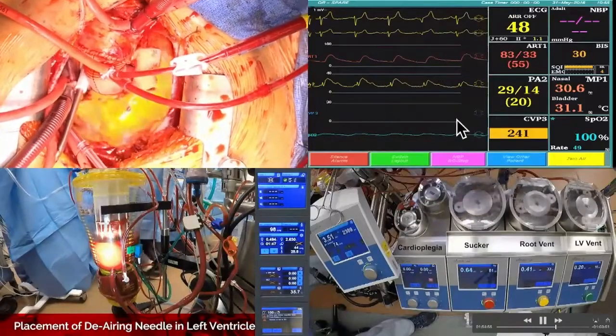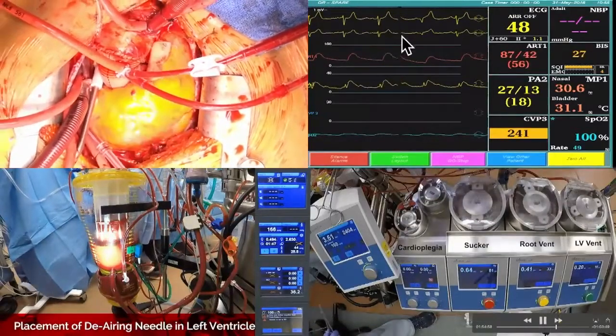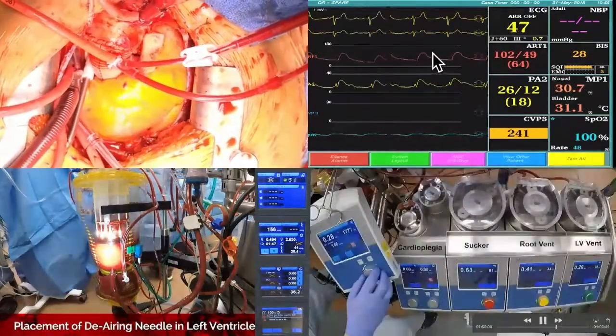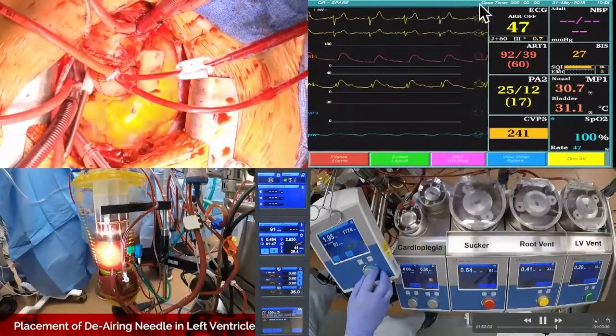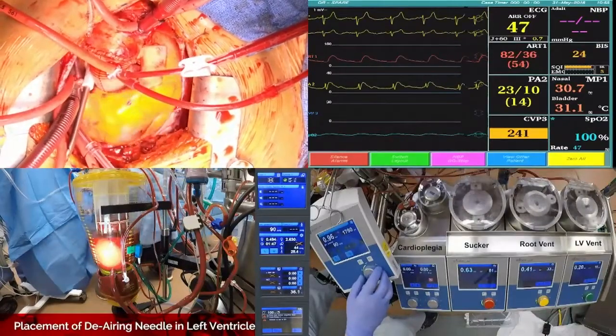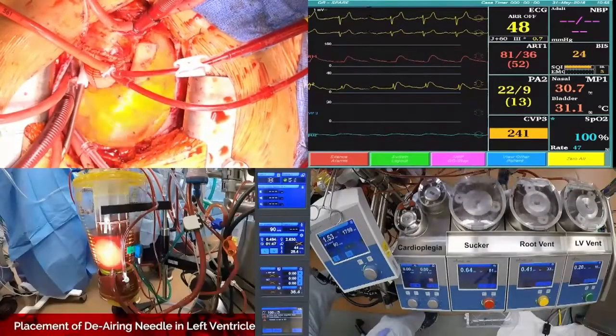And if you look here, the pulse pressure is pretty wide for a low. It should be a narrow pulse pressure, just from that number. That's another indication of AI, because you're not getting a good dicrotic notch. So why would that valve hold the water? Is it just because of the pressure? Yeah, it's just a lot more pressure. And maybe due to the geometry, where it's squeezing, it's opening, and coaptation. It's lots of different things. Again, the leaflets are very asymmetric. It was pretty obvious there. You could see that the right coronary leaflet was big, and the others were like a quarter and a half, and that's just not normal.